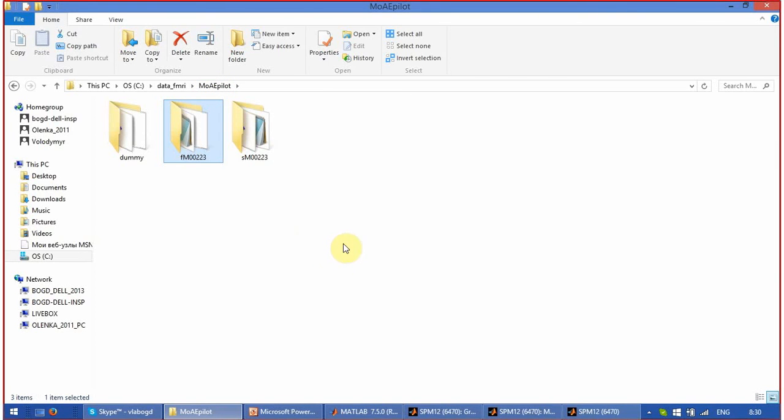It is very useful because of a high risk of errors and inconsistencies. And if you keep all the data there is no problem to go back and reanalyze the data to see if there was an error or your results are good and correct.